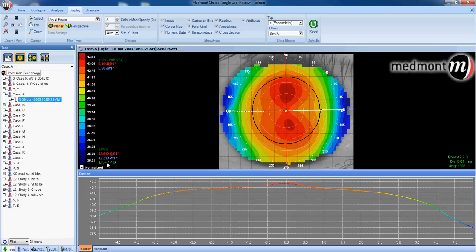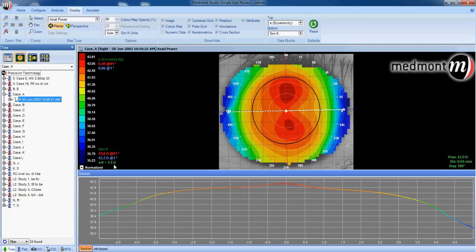In this case, the flat K is 42.2, steep K 43.6. The flat K is along axis 1, steep K at axis 91. We can also see that this cornea has 1.4 diopters of corneal astigmatism.